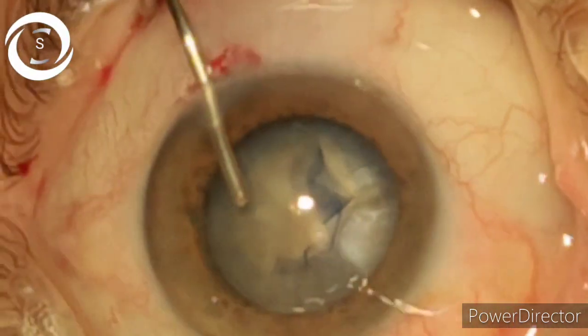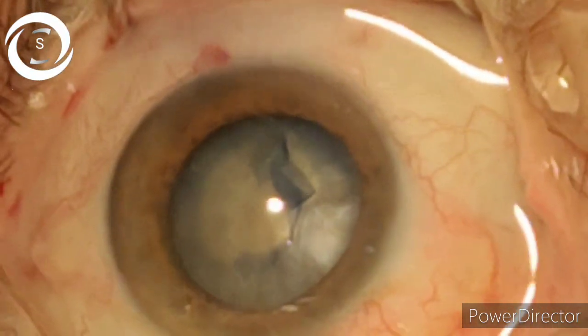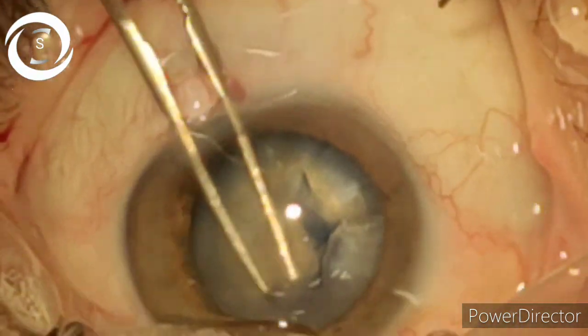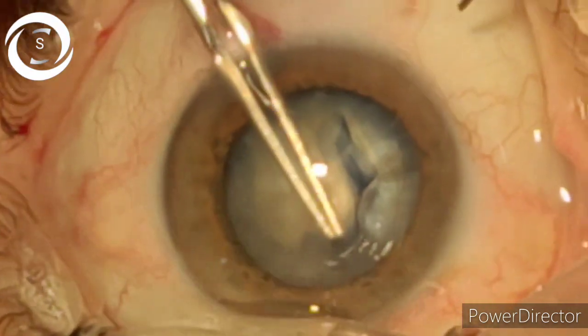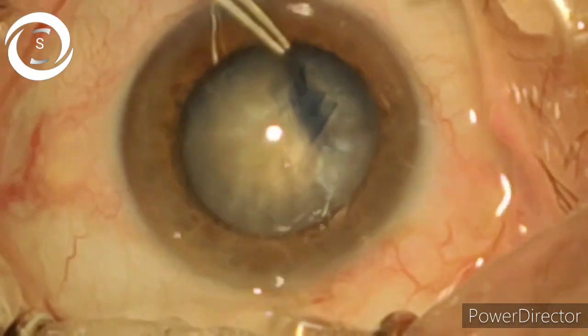In a very mature cataract like this one, if you end up with a smaller rhexis, you will be in trouble. So here at the end, I am enlarging it further with the help of capsulorhexis forceps, very gently.